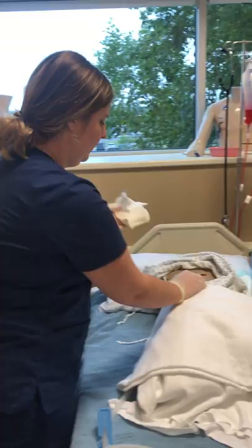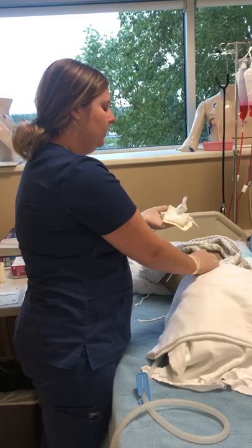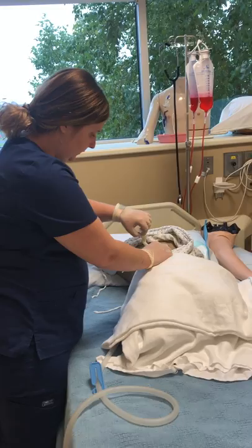Then this would go into a biohazard bag, but before doing that, I'm going to check if there's any drainage, and I would assess the color, if there was odor, the consistency, and the amount. So now I'm going to put that in my biohazard bag. And then I'm going to remove this.